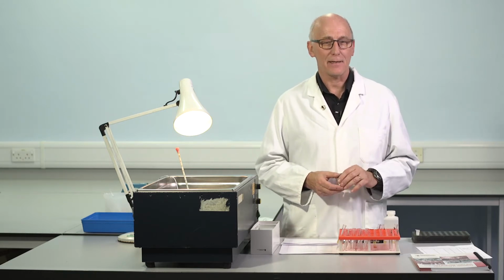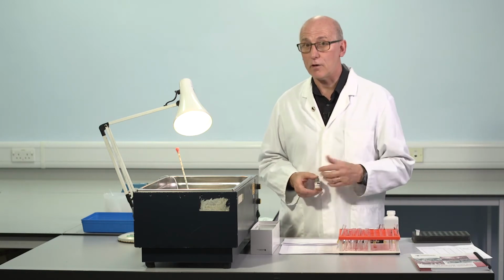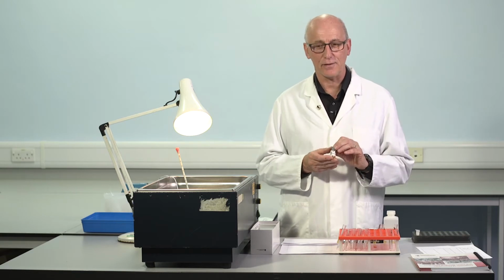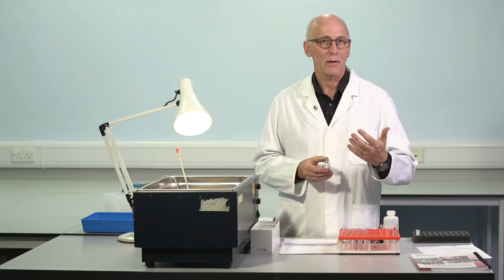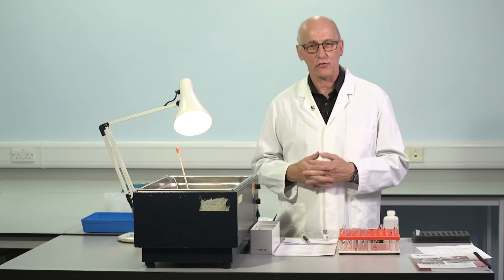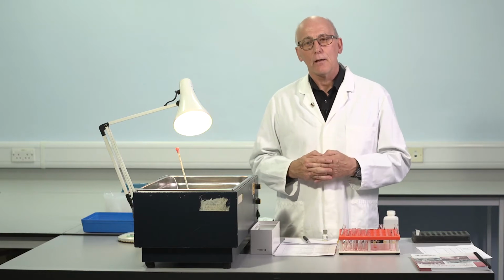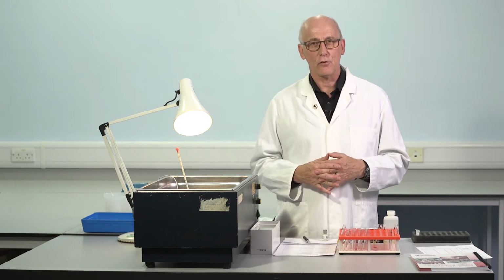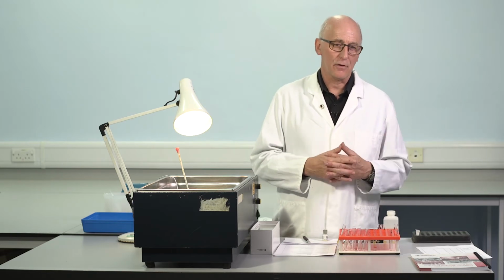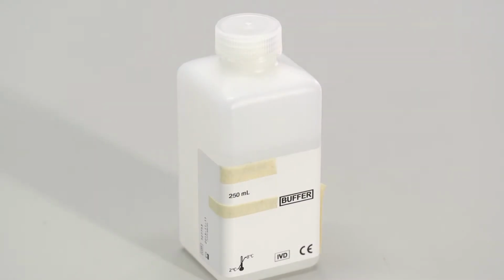We'll start today using a 1 in 10 dilution, and then we need to prepare additional dilutions, more diluted, lower concentrations of factor VIII. So the first thing we're going to do with this material is to construct some dilutions. There are a number of studies which have looked at the use of different diluents to construct those dilutions and the calibration curve. The majority of factor VIII assays currently are done using buffers like imidazole buffer, glycylglycine buffer, like Owren's buffer, but crucially with a pH of 7.35. This is the most frequent material which is used, and it works extremely well for the majority of settings.